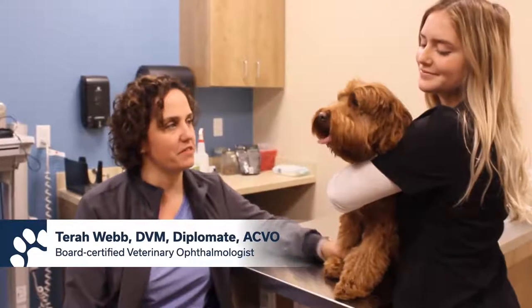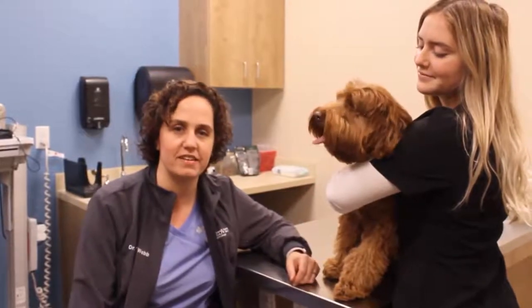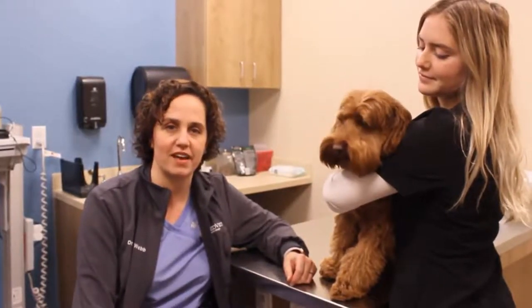Hi, I'm Dr. Webb. This is my friend Max and Miranda and today we're going to demonstrate a comprehensive eye exam.